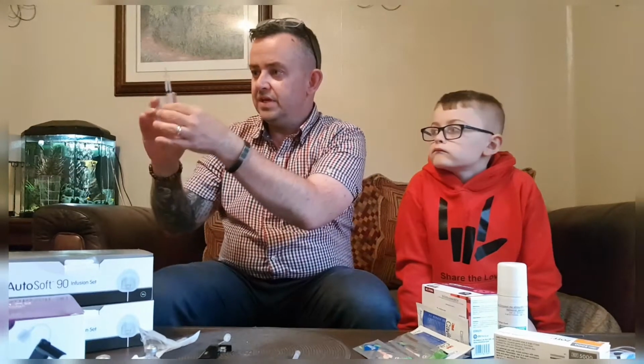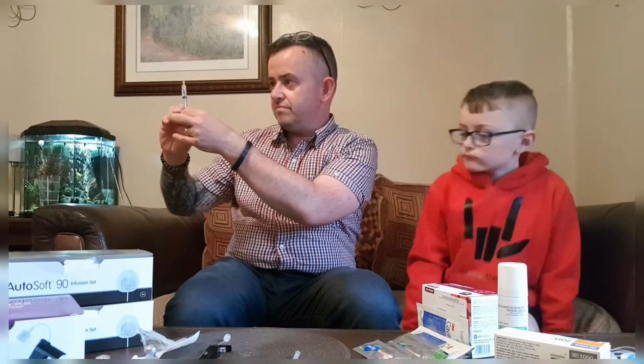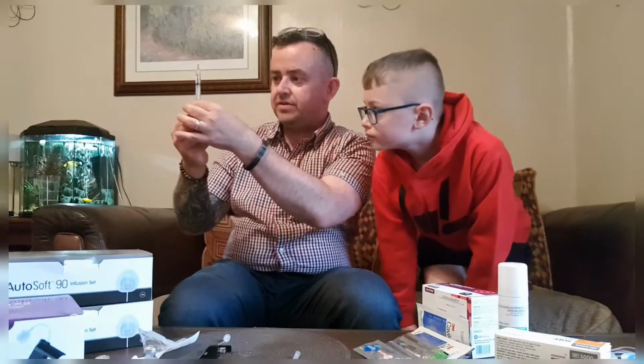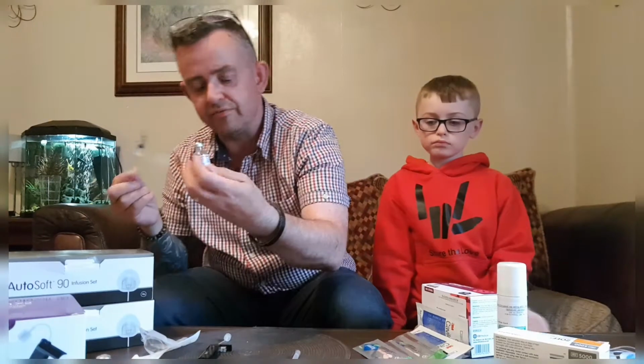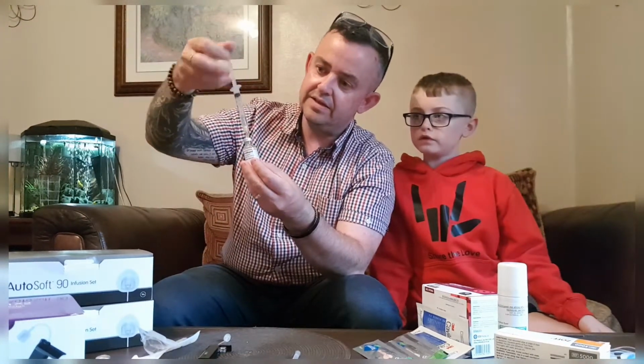So, let's just get the air out of that one. If we push that up, until it doesn't, then pull that back to 3 ml. Where's the new one? That's the new one. Push all that air in there.